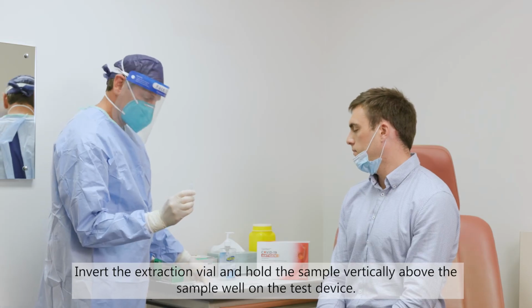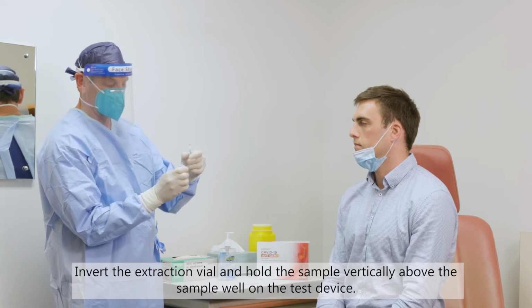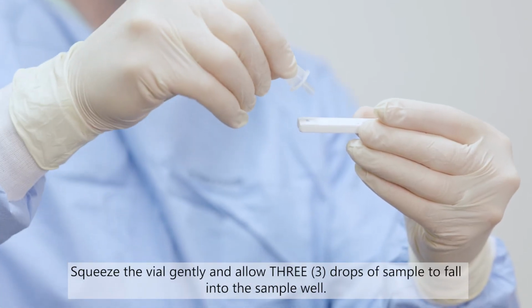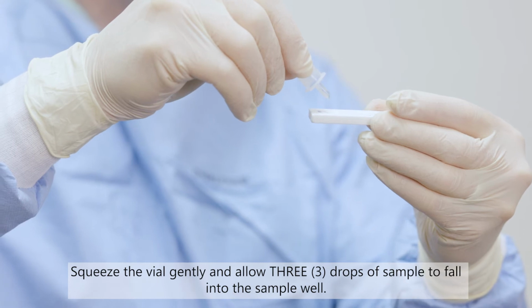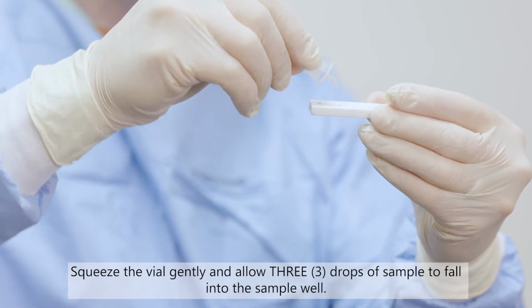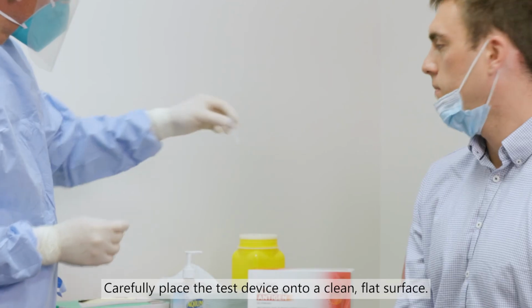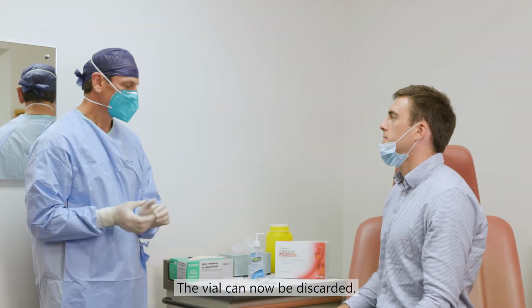Invert the extraction vial and hold the sample vertically above the sample well on the test device. Squeeze the vial gently and allow 3 drops of sample to fall into the sample well. Carefully place the test device onto a clean, flat surface. The vial can now be discarded.